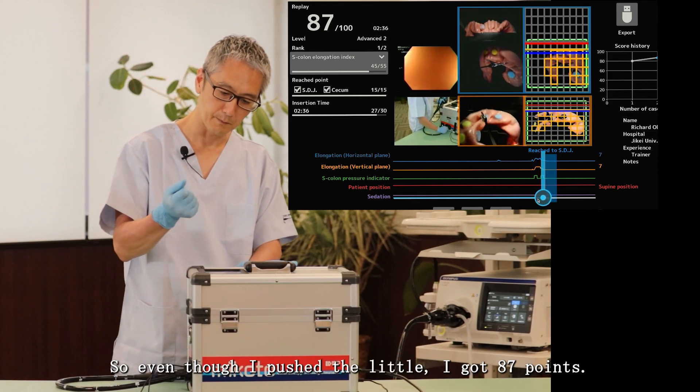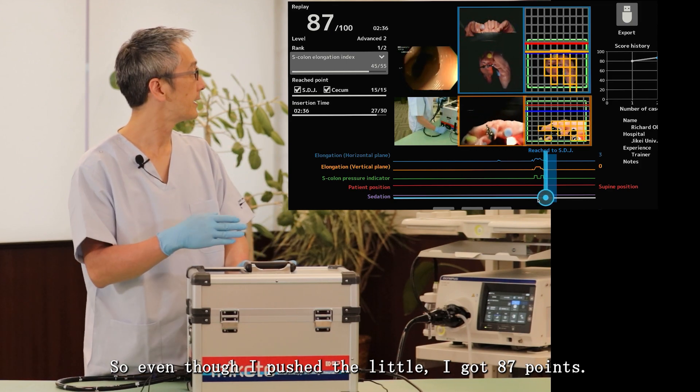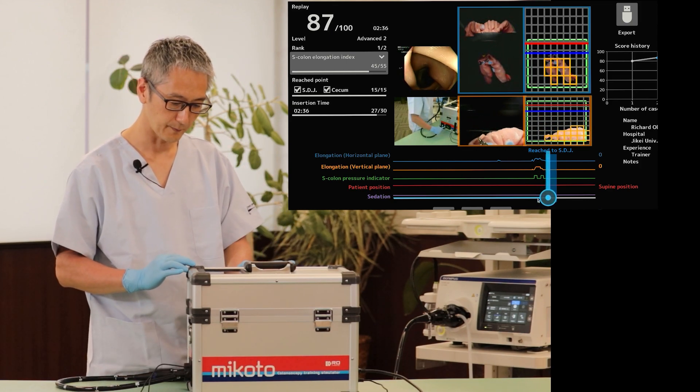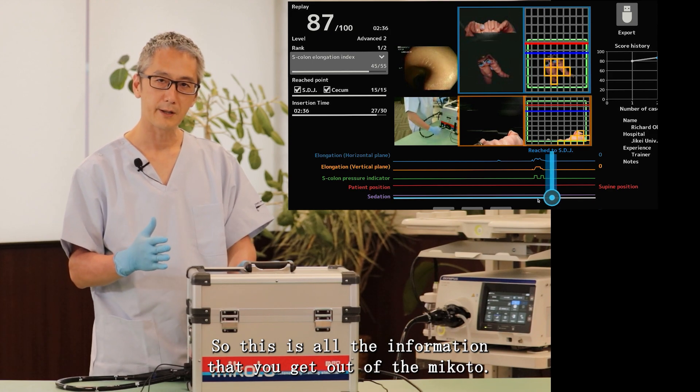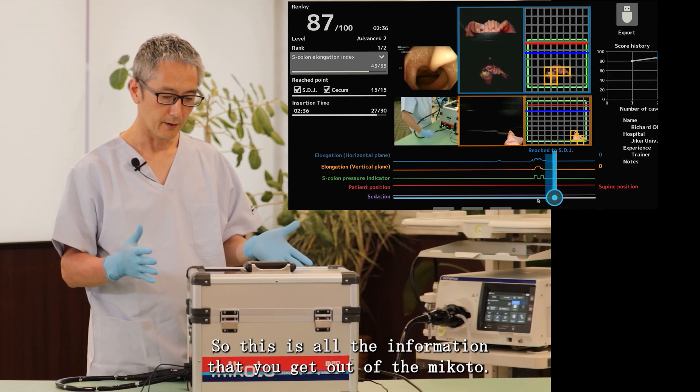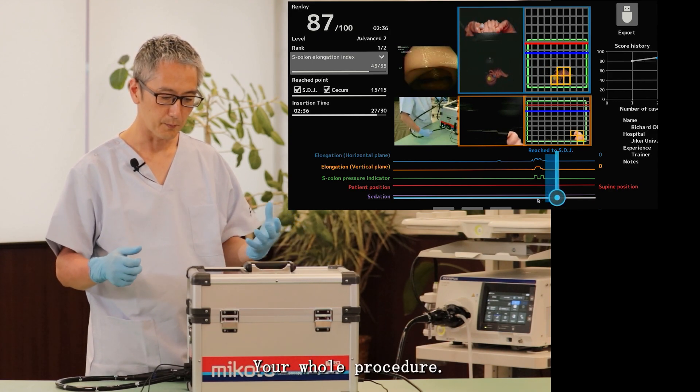But still sufficiently managed to shorten the sigmoid colon quickly. So even though I pushed a little, I got 87 points. So this is all the information that you get out of the Mikoto, your whole procedure.